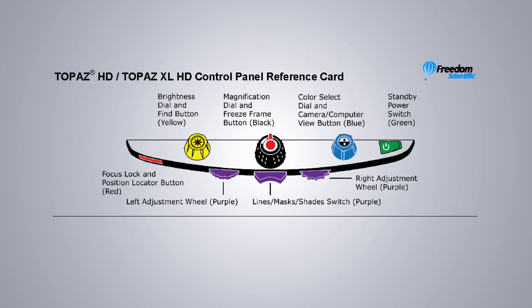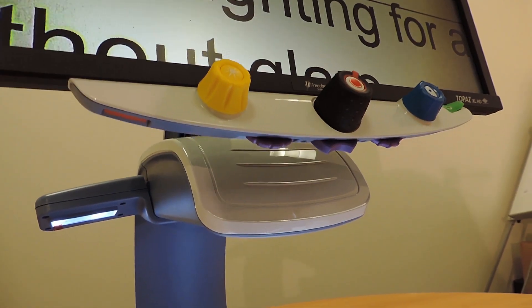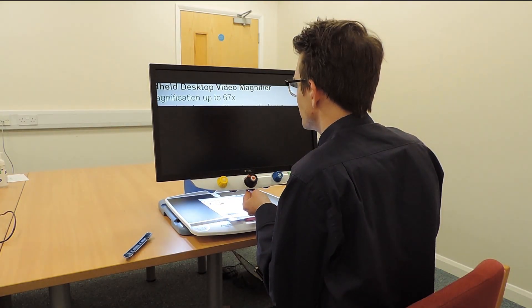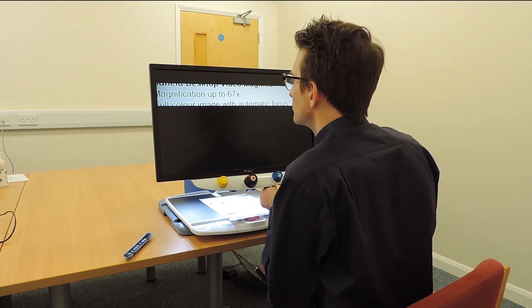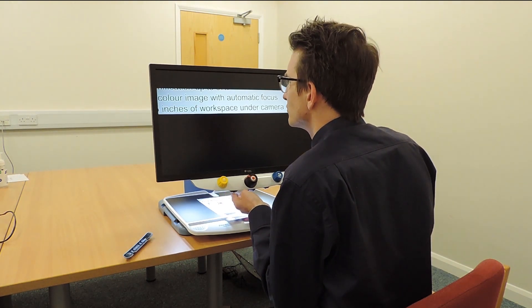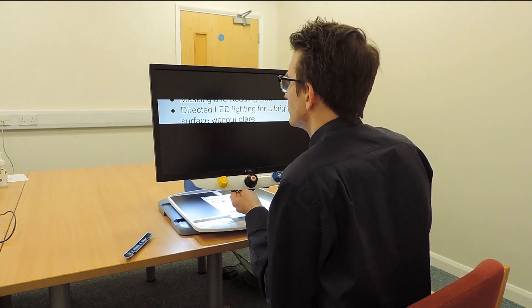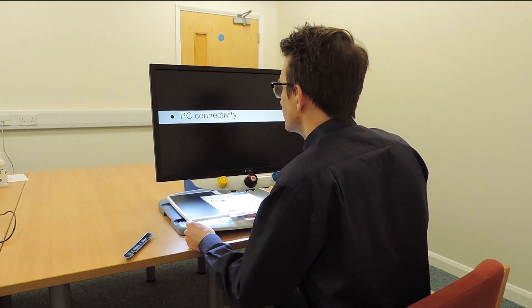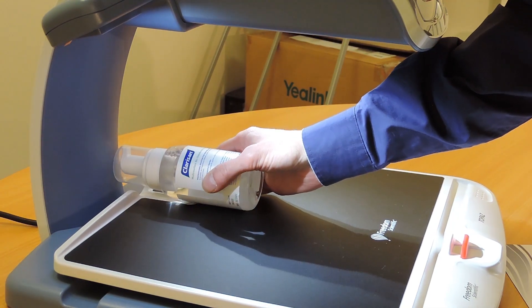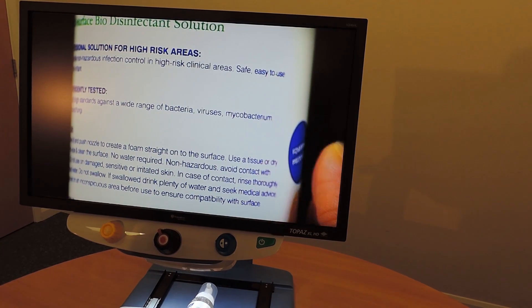On the underside of the control panel there's a plastic panel which you can remove. This will expose the left and right adjustment wheels and a switch in the centre to cycle between lines, masks and shades. There is also a neat feature on the XY table: a groove that enables you to place a curved object such as a medicine bottle or a can for easy reading of the text without having to hold it in place.